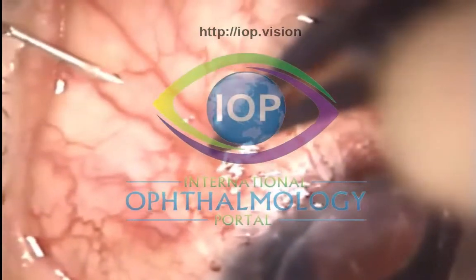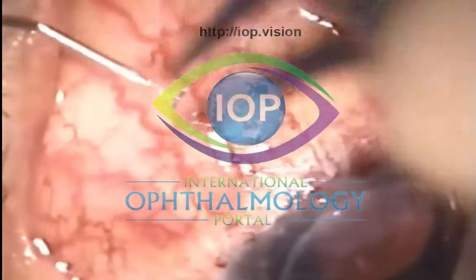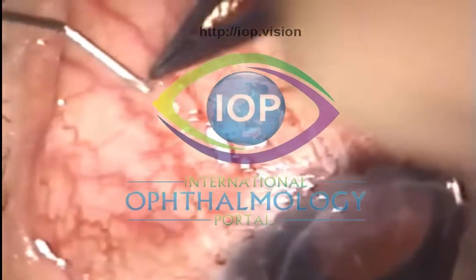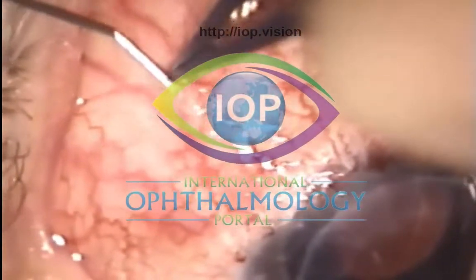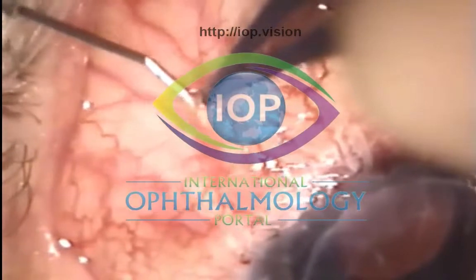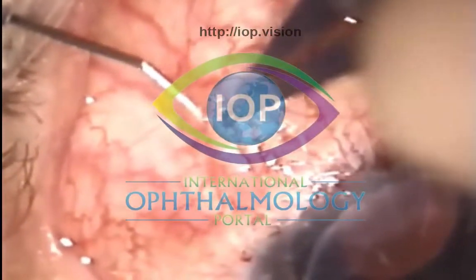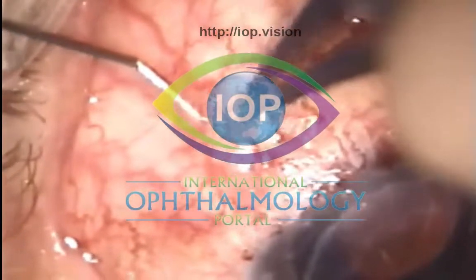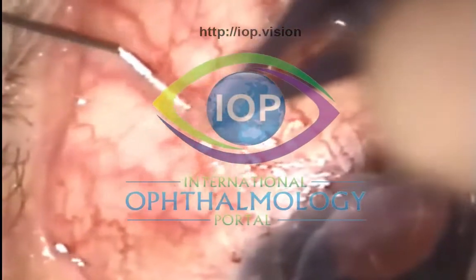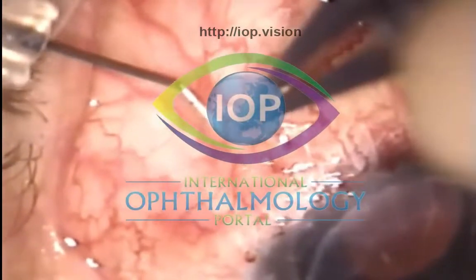The tissues are rather tight. Again using the technique of infraducting the eye and pulling the superior tissues down to get an entry. As I'm going forward, I lose sight of the needle tip because the tissues are so thick. I'm lifting the conjunctiva off the needle tip as I take it forward, and you can see how thick the tissues are.